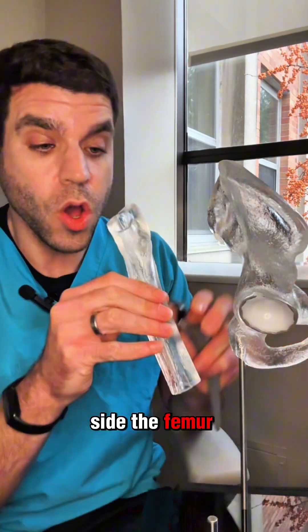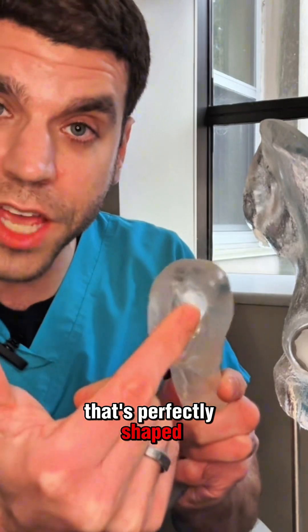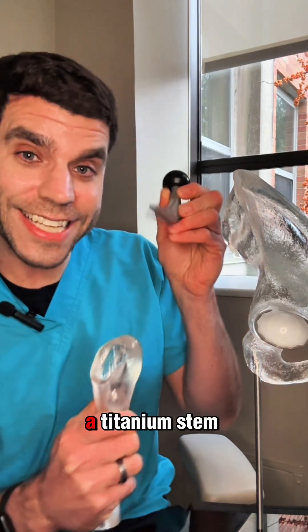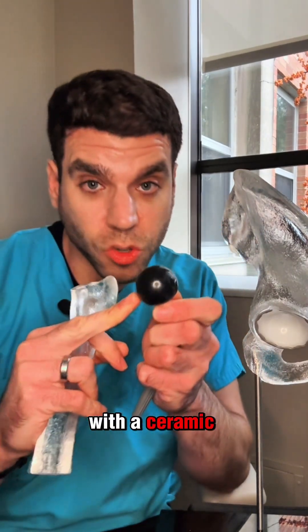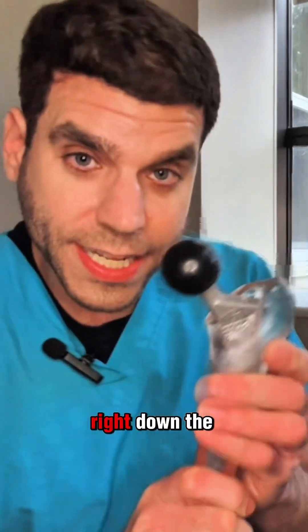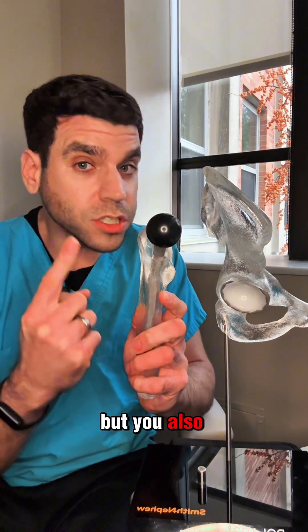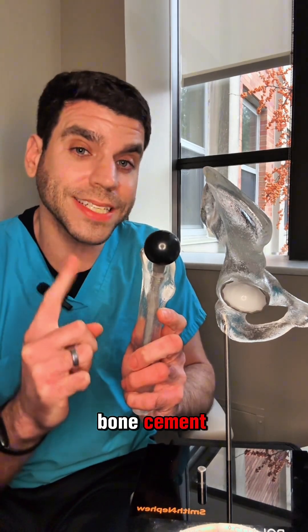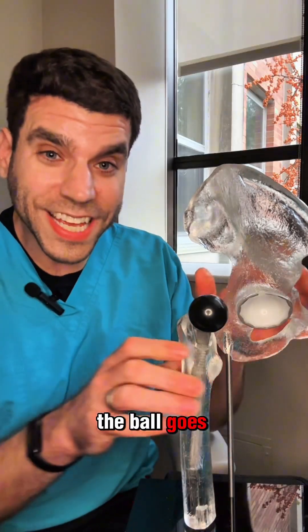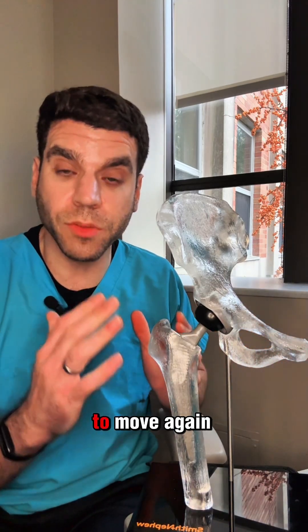On the thigh side — the femur — we create a hole in the center of the bone that's perfectly shaped to fit your specific anatomy. Once we have the right shaped hole, we take a titanium stem with a ceramic ball head on top of it, and that fits right down the middle of the bone. This is also made out of porous materials that your bone will grow into, but you can also glue it in place with bone cement — it just depends on the patient. Once these parts are in place, the ball goes into the socket, and the soft tissues around your hip hold it in place and allow you to move again.